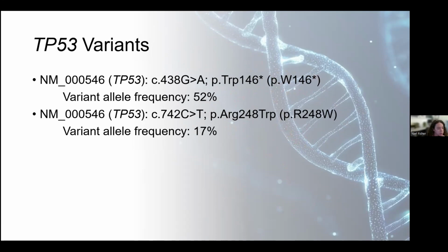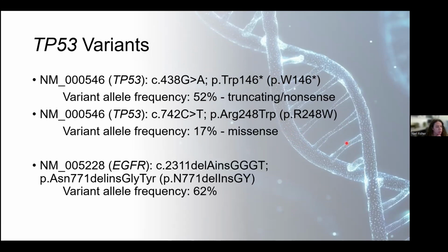Now, this wasn't the only result we had in this case. We also found an EGFR exon 20 insertion, which helped in the diagnosis of this tumor as a tumor that is suspected to be an inverted papilloma. And if you look at the allele frequencies, this was present probably in all tumor cells, as opposed to the p53, where each mutation was present in a different population.